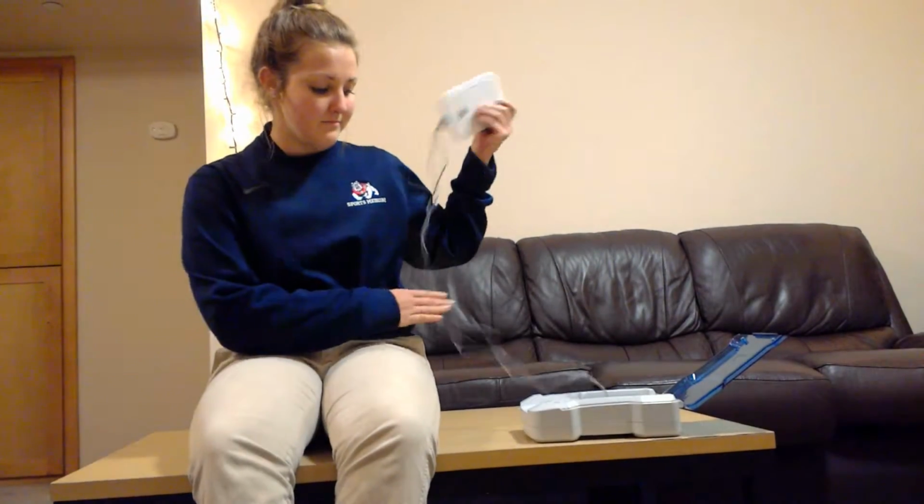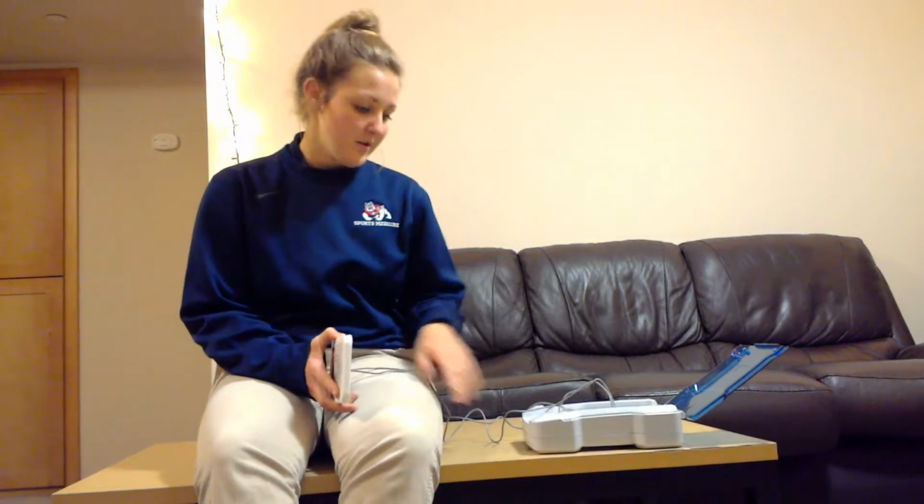After the AED comes and I've already started my CPR, I would turn on the AED. It's very simple. I would push the power button, and it will take me through step by step if I was someone who wasn't familiar with it or needed some refreshing. It tells me step by step what to do. So I would turn it on, and first it would instruct me to clear the area.